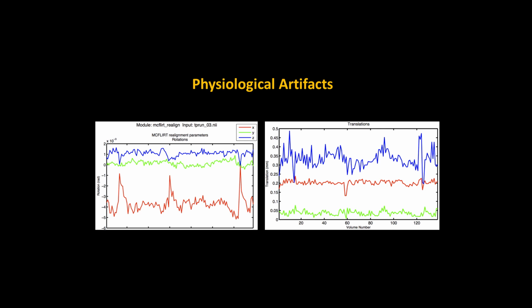If they have a sudden movement that's more than, say, half a voxel, because, say, they've sneezed or they've moved suddenly, that also might be a candidate to remove. You can try different methods. You can try interpolations. You can try scrubbing. Again, it really is up to you, and it depends on what kind of population you're analyzing. But in any case, I always say that prevention is the best cure.